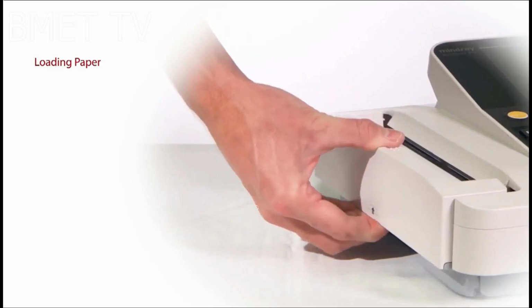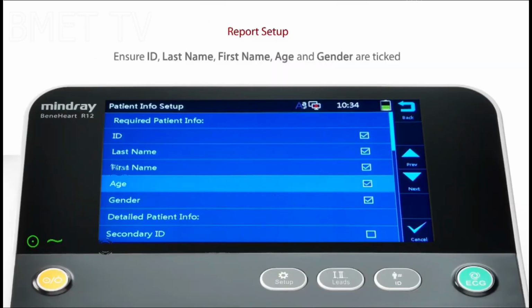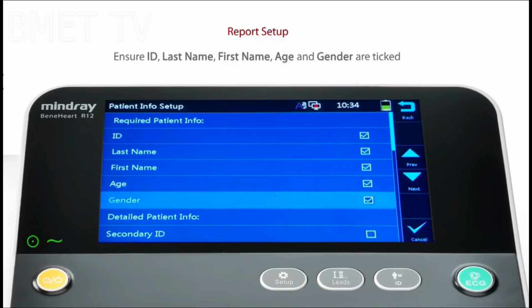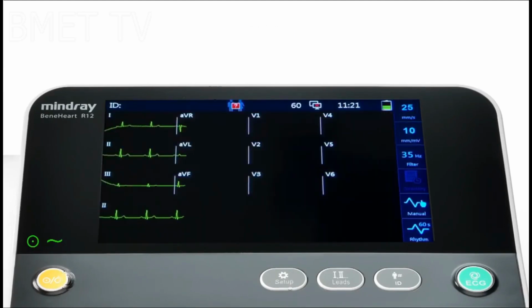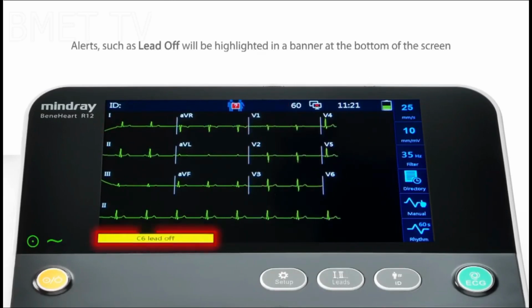And the fourth component is the cardiograph. Cardiographs consist of a CPU, the printer assembly, and the user interface to interact with the machine. The machine analyzes the ECG electrical complex for various intervals and displays them to the user. The user can transfer the ECG to his system, print or store the ECG in the cardiograph itself.